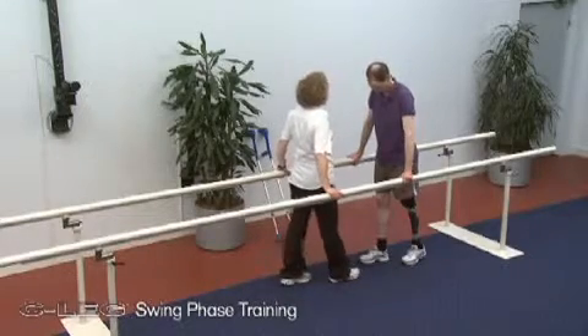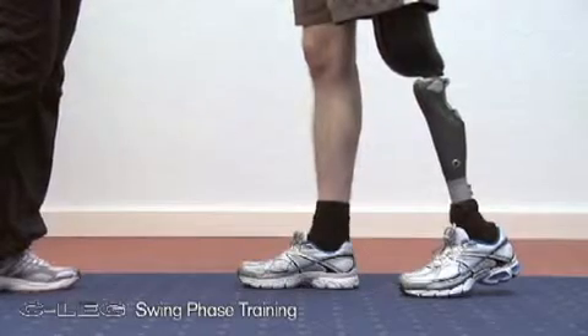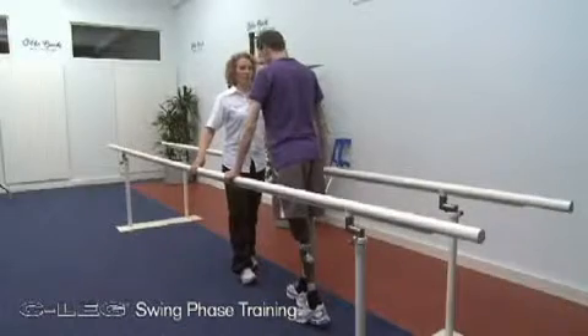Parameters for the initiation of the swing phase are the extension of the prosthetic knee joint with simultaneous application of the maximum toe load within a short period of time.